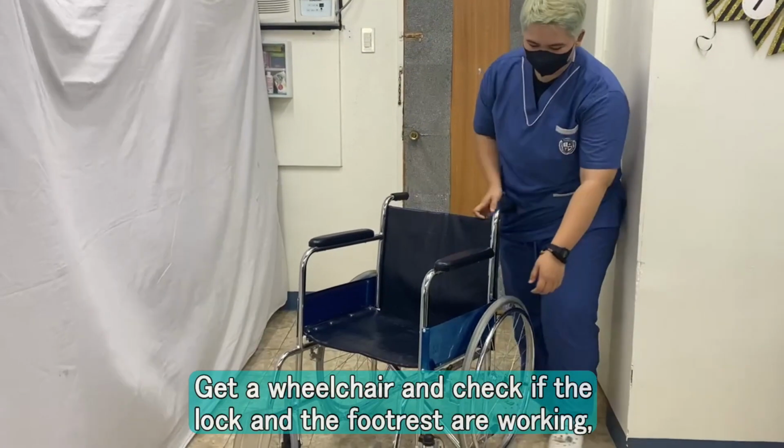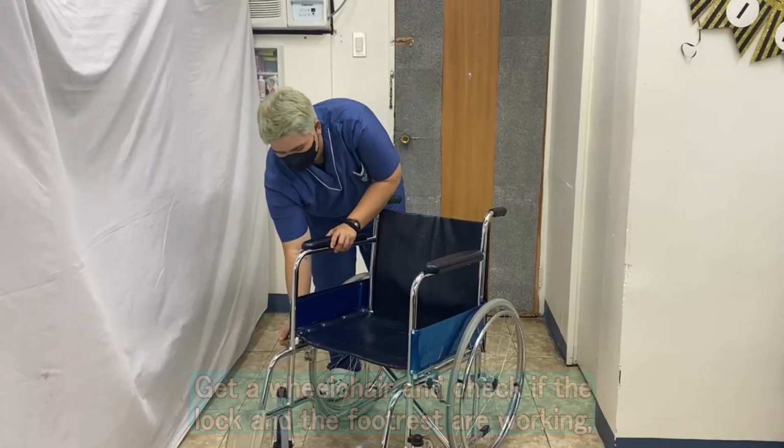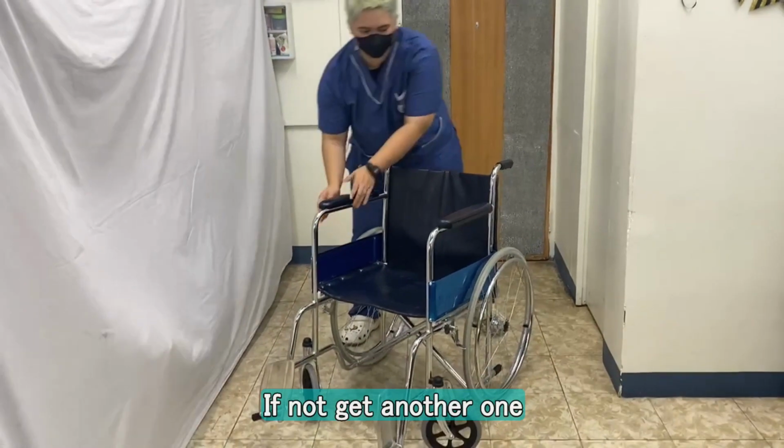Get a wheelchair and check if the lock and footrest are working. If not, get another one.